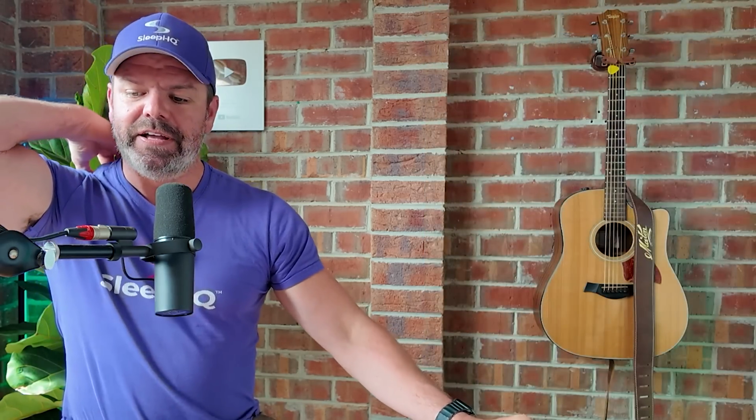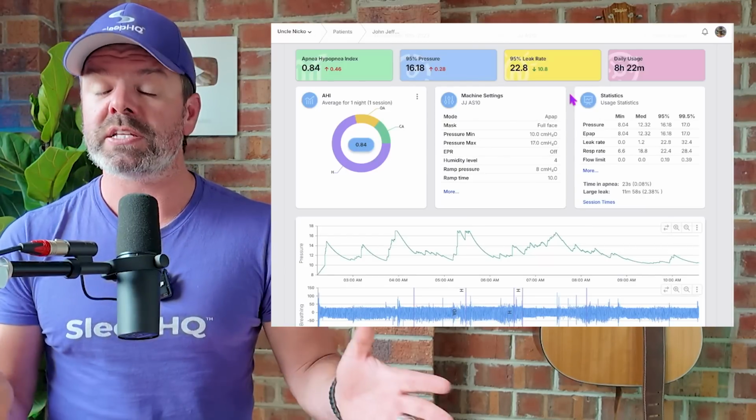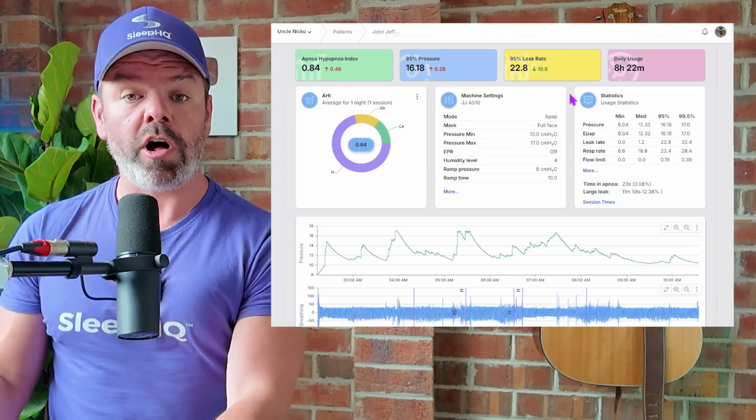Really advanced stuff. All right, now today we're looking at John Jeffrey's profile. G'day, John, a fellow Aussie SleepHQ Pro member. Thanks for letting me share your charts for this educational video. John, really appreciate it. Hope you're having a great day. The principles which I'll teach you in this video can be pretty much applied to any CPAP machine. You just might need to tweak them a little bit with some trial and error.